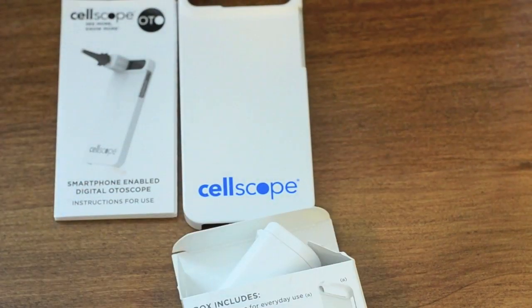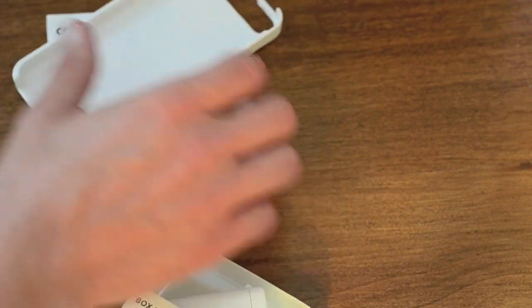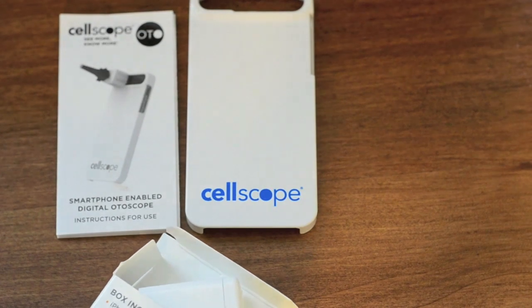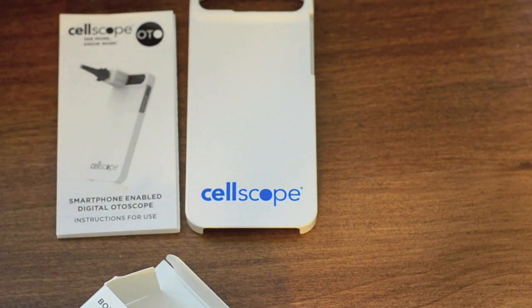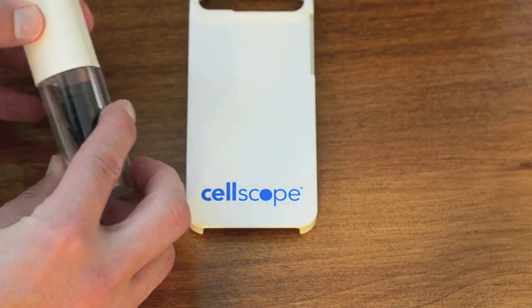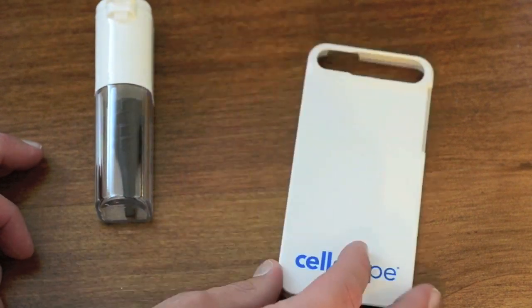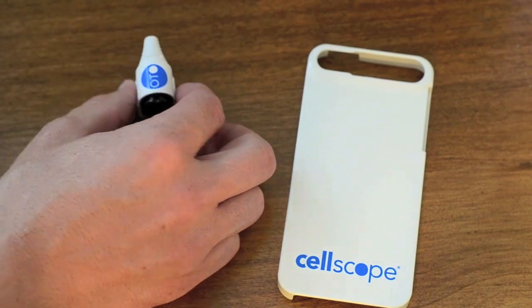It just fits on like a normal cell phone case, and you could see that you could actually just leave that on your phone and pull the actual scope on and off as needed throughout the day in the clinic, making it really easy to still use your phone and be ready to use the scope at any time. There's the actual scope, here's the storage case — stick that in your white coat and then pull the scope out.